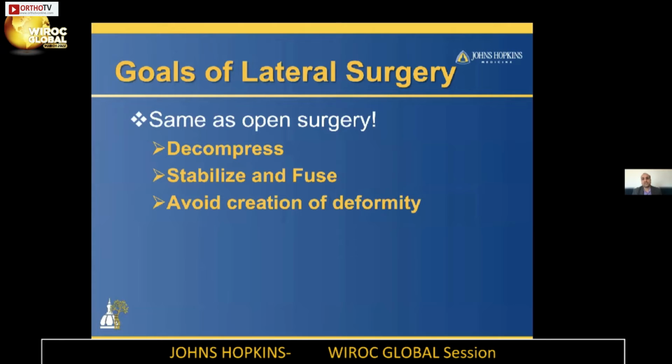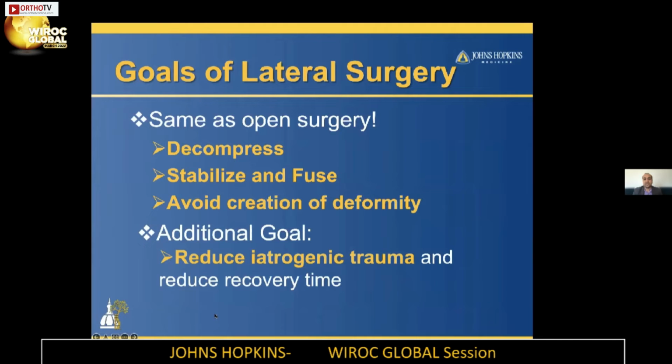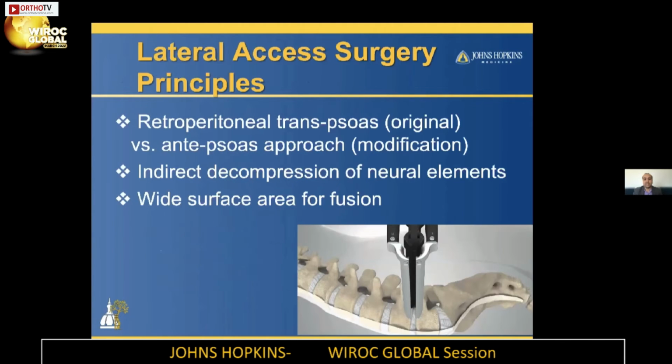So what are the goals of lateral surgery? Well, they're really the same as open surgery. The goals are to decompress the spine, stabilize and fuse the spine, and avoid creation of deformity. And the additional goal is to reduce iatrogenic trauma and recovery time.